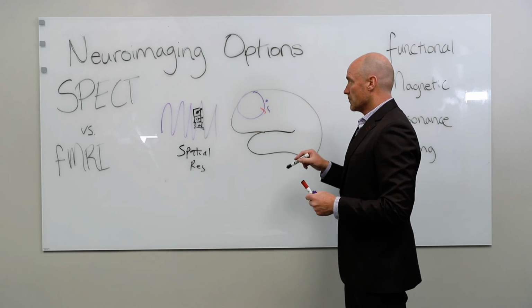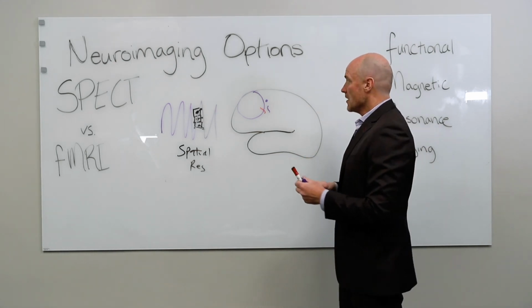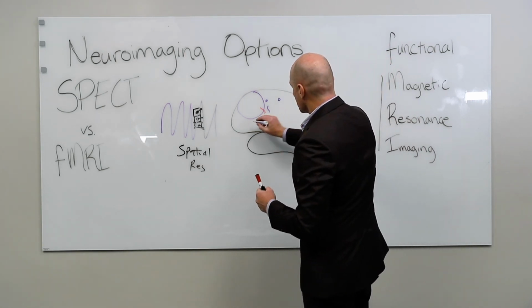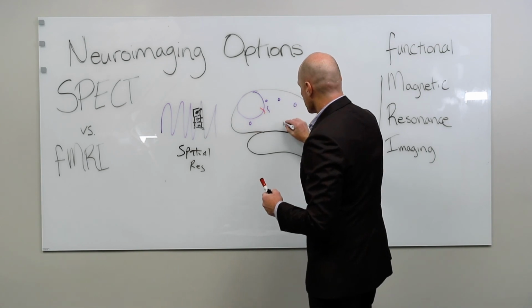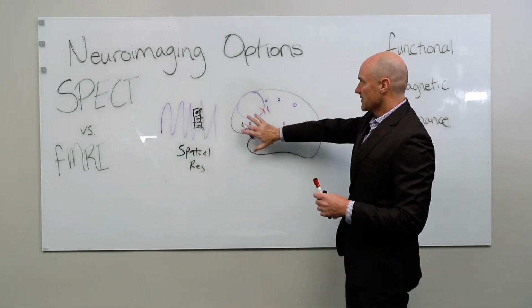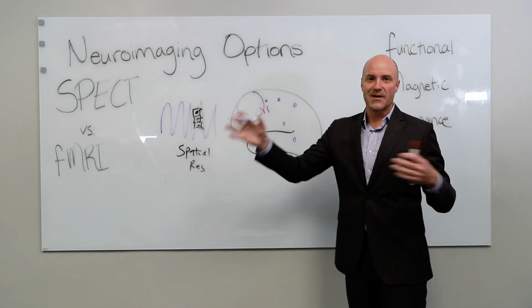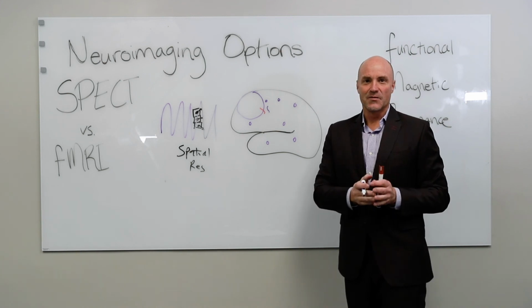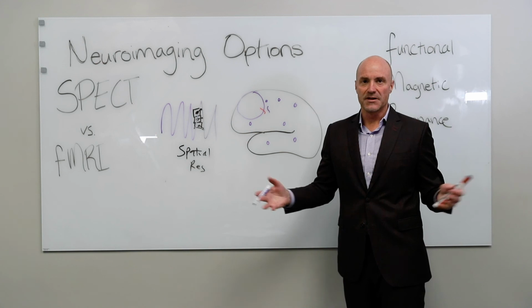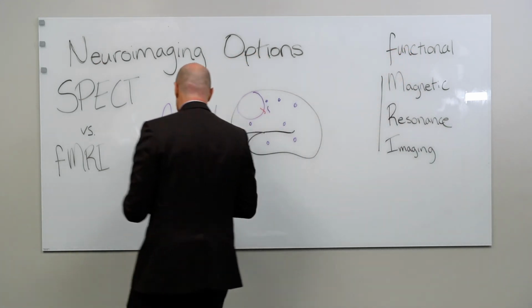The other component then, temporal resolution, is also important because, like I said, if you've got lots of discrete regions that are involved, sure, fMRI can pick up those regions well, but if there's poor temporal resolution, basically you're picking up the whole brain because you're picking up everything that happened over time. So over the last 5 minutes, all of these areas were activated. It's going to show almost the whole brain being activated. So what you want then is temporal resolution.